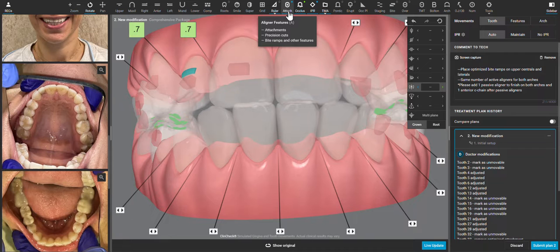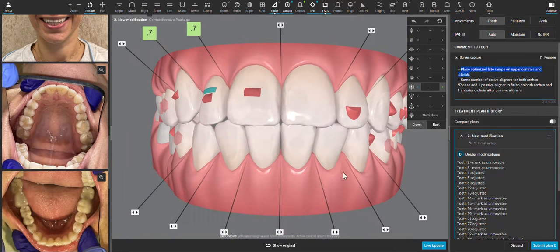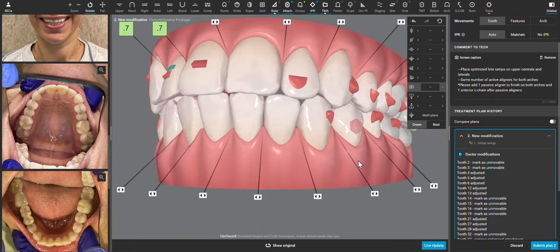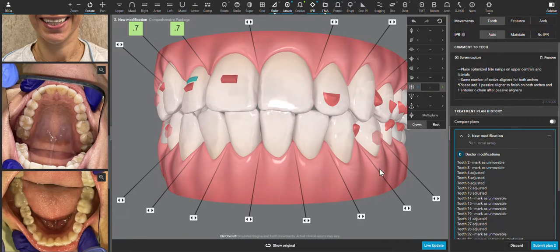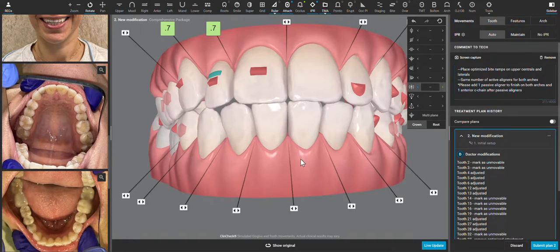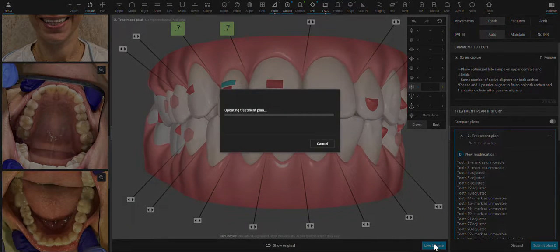Now we have the case pretty close to set up the way we want it for the patient's goals. I'm going to ask for bite ramps, as I find them always helpful to prevent the molars from passively intruding and creating a posterior open bite. I like to have the same number of aligners upper and lower, so one of the arches will be extended. This is also a helpful way to add two aligners to the end of the case that you can use as a temporary retainer, or an aligner the patient can wear while waiting for additional aligners or a retainer — and sometimes when the teeth move, they get a little more mobile and might need some tightening of contacts at the end. Those are just-in-case aligners. I will then wait for the live update, as this will put all the changes I made with the 3D controls in place right away, and then we'll have a ClinCheck that we're just about ready to approve.